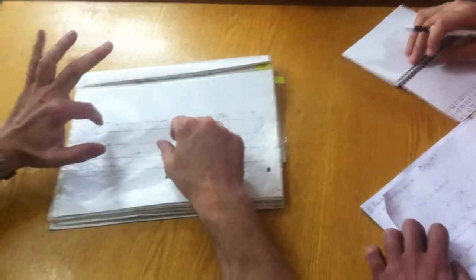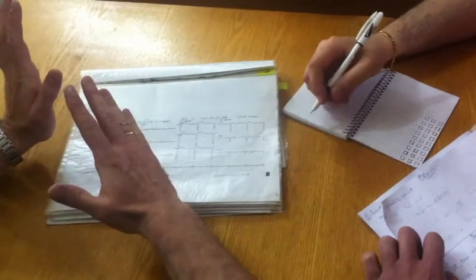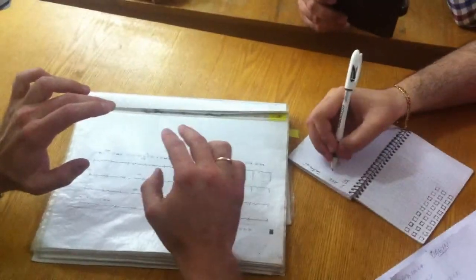New words. So lead 1 and AVL: it's the lateral wall of the left ventricle. Lead 3 and AVF: it's the inferior wall of the left ventricle, the inferior or diaphragmal wall.